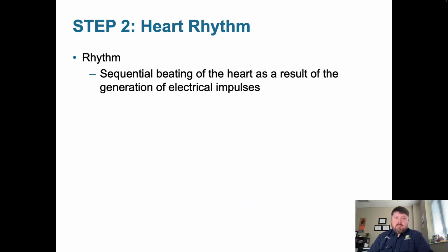Heart rhythm, step 2. So our first step was heart rate. Our second step is going to be heart rhythm. And this is going to be the sequential beating of the heart as a result of the generation of electrical impulses.